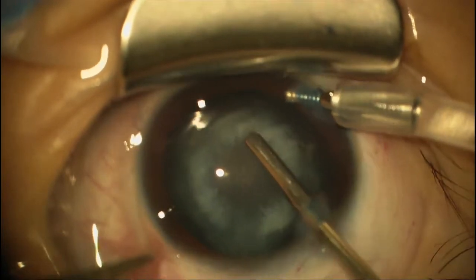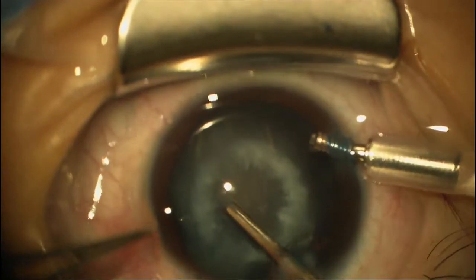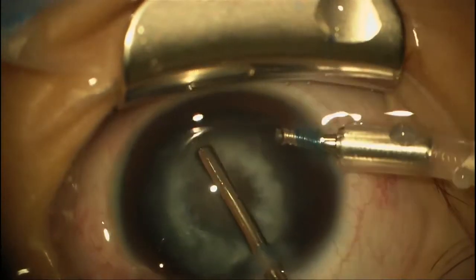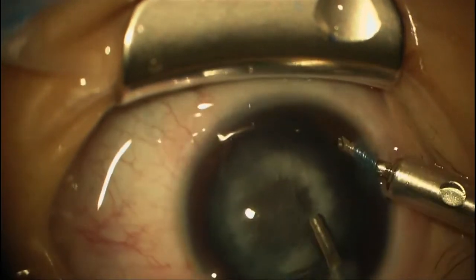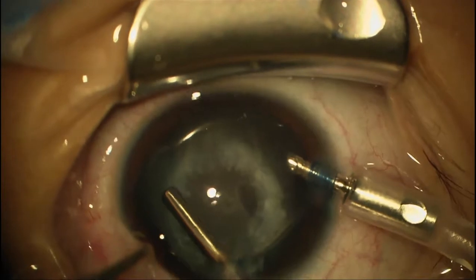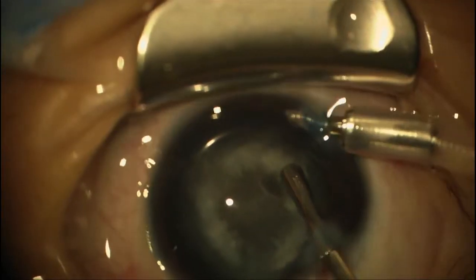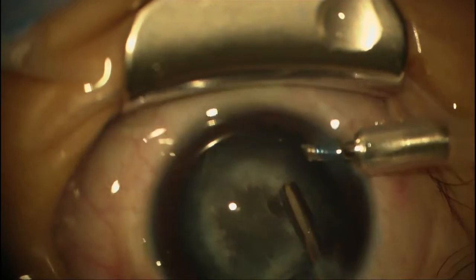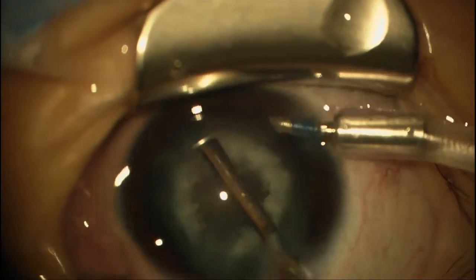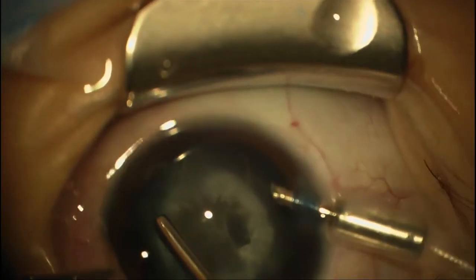We've just got the central capsule open. You can see how this capsule behaves — it gets real stringy. We're trying not to disturb the underlying lens as we go around on this capsulotomy. It's real important not to aspirate too much because it'll pull the back of the lens right up through. We're almost to a size I'll be happy with — just a little bit more. It's a very friable capsule.